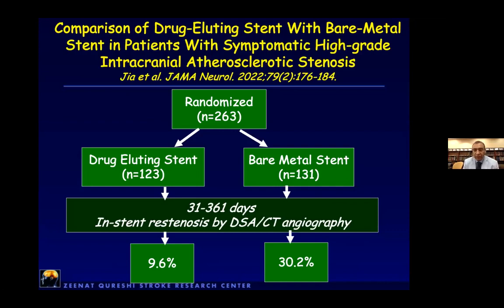And the explanation may be in-stent restenosis. So obviously restenosis can occur. And the purpose of drug-eluting stent is to actually elute, which is to release the drug over a period of a month into the arterial wall. And these drugs are anti-proliferative agents. So meaning that the anti-proliferative agent that diffuses into the arterial wall prevents proliferation, which is the basis of restenosis.